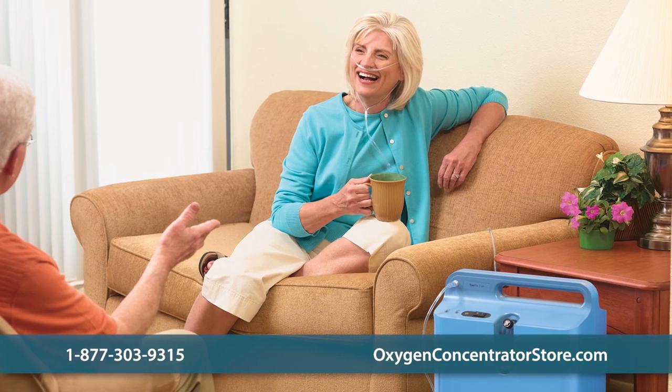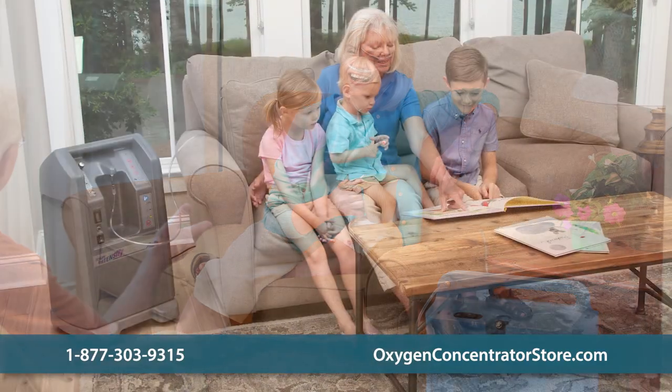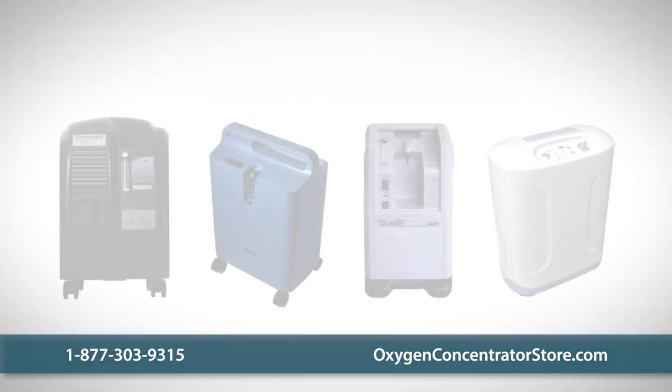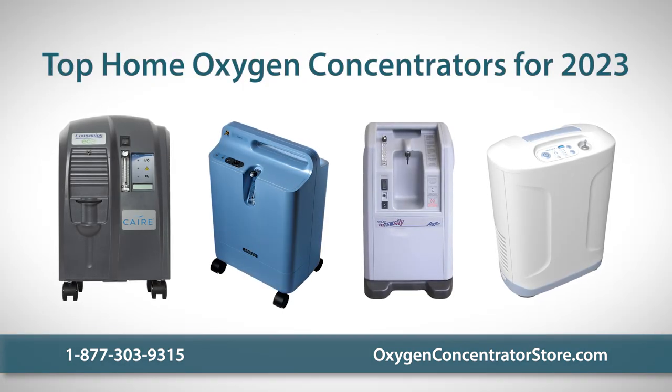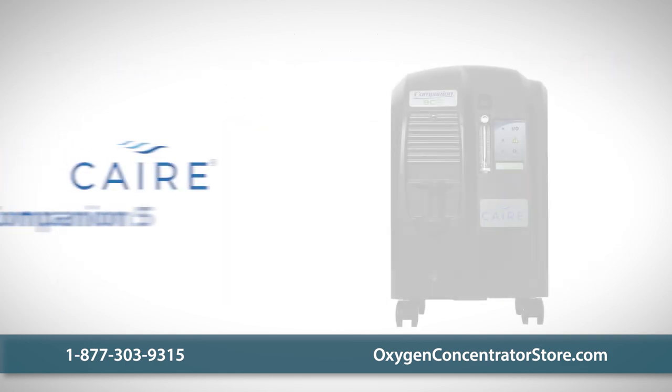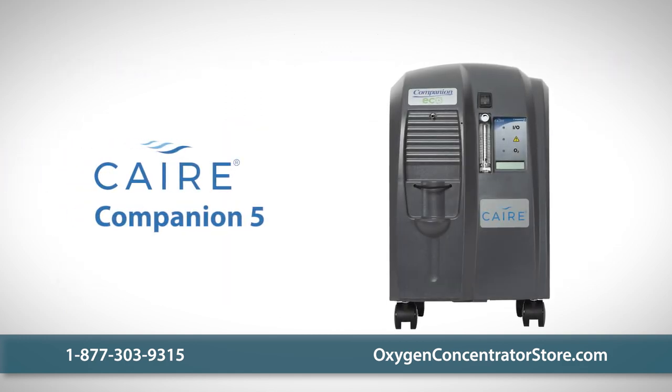If you have been searching for the ideal home concentrator, look no further. We've rounded up the top home concentrators for 2023, paying special attention to the various features and qualities of each unit.